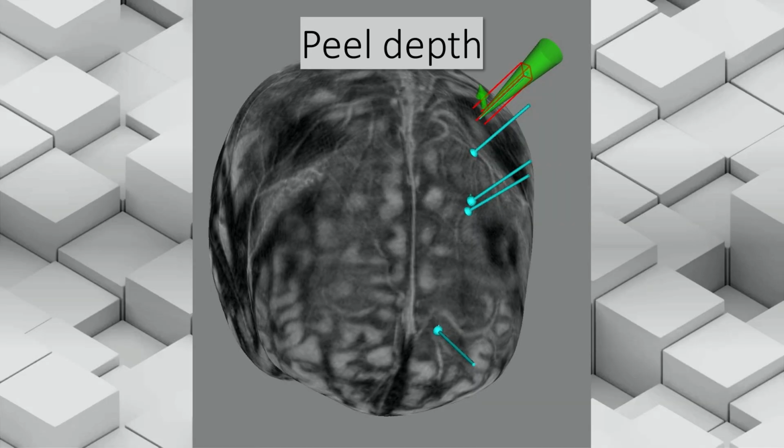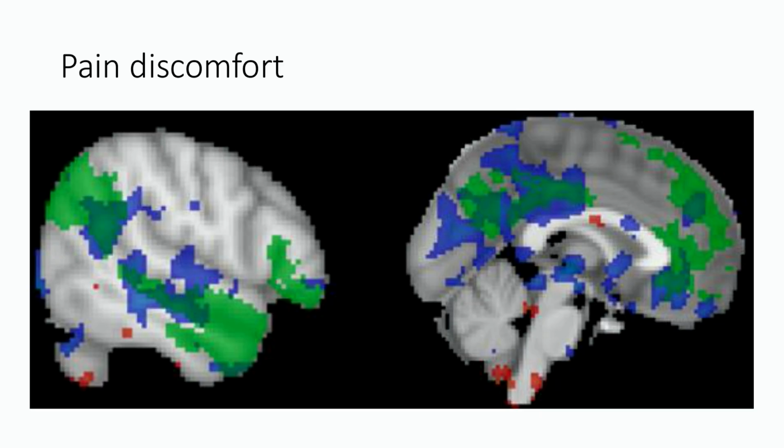It's not that this particular cluster or blob is not a good one, but looking at your data carefully will tell you whether it looks like a spurious target or not. If you don't look at it and you just assume the peak is usually not the best place to stimulate in the most valid brain region.